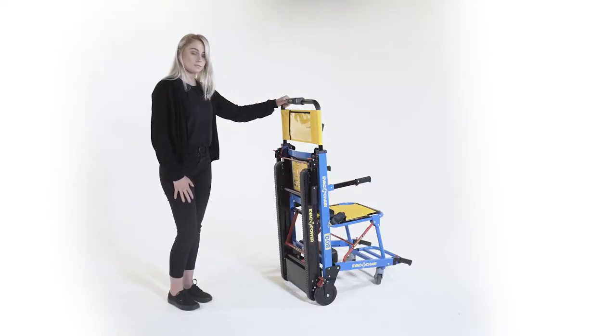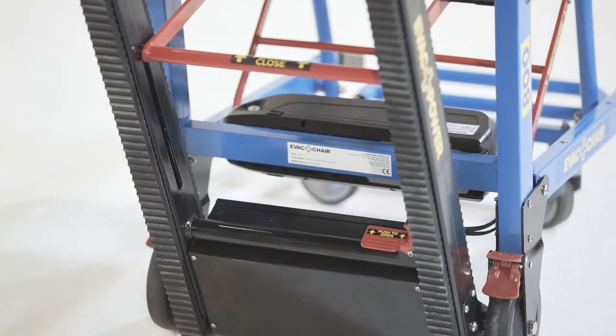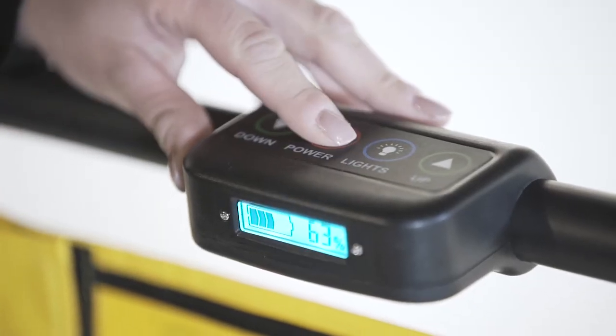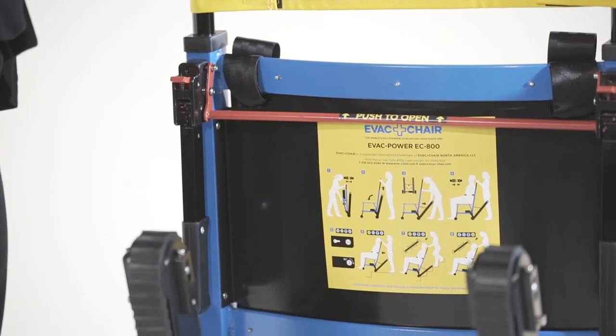To release the tracks, use your foot to press the release pedal and tracks will glide into position. Ensure power is on and press either the up or down arrow to move the tracks in the direction required.